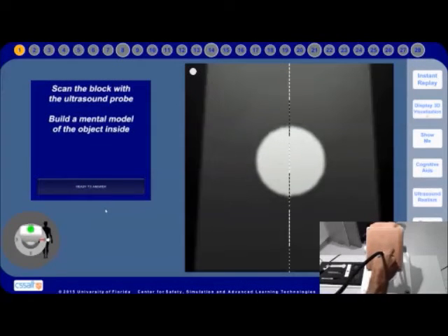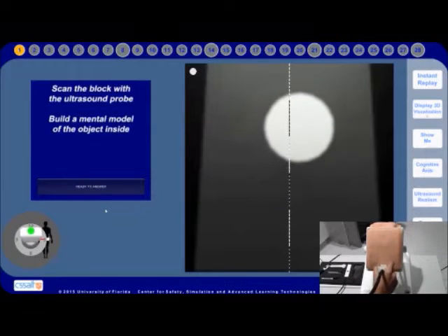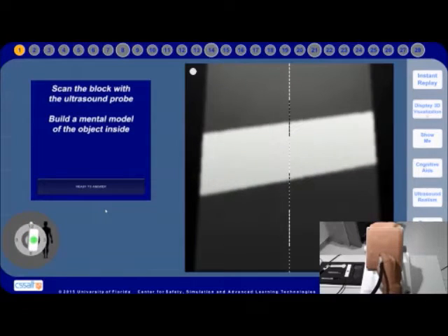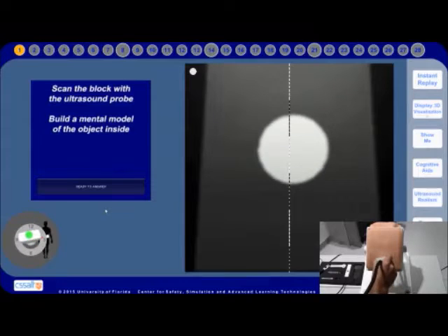The reading exercises place single shapes for the user to scan. When the user is ready, they are presented with a multiple choice question and choose the correct picture of the shape from a list of objects.